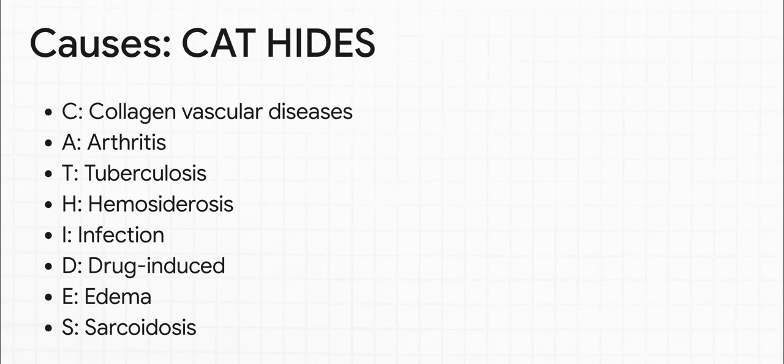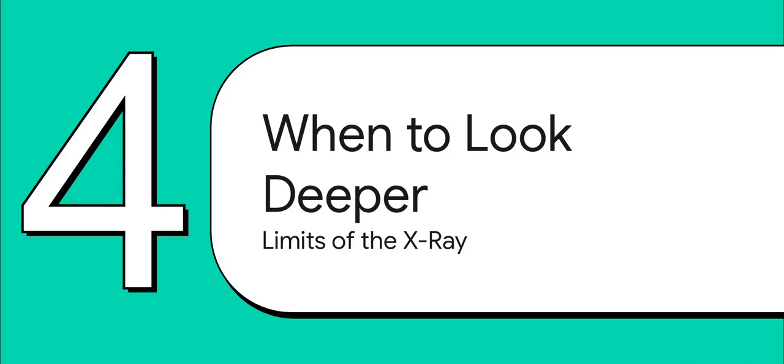You know, this whole systematic approach doesn't just stop with reading the image. To remember all the different things that could cause a condition like this, doctors use mnemonics here too. It's just another layer of the method, another tool to help them navigate a really complex diagnosis. But here's the thing. As powerful as the chest X-ray is, it doesn't always have all the answers. Sometimes it's great at finding a problem, but it can't tell you exactly what that problem is. And that's when you have to call for backup and look a little deeper.